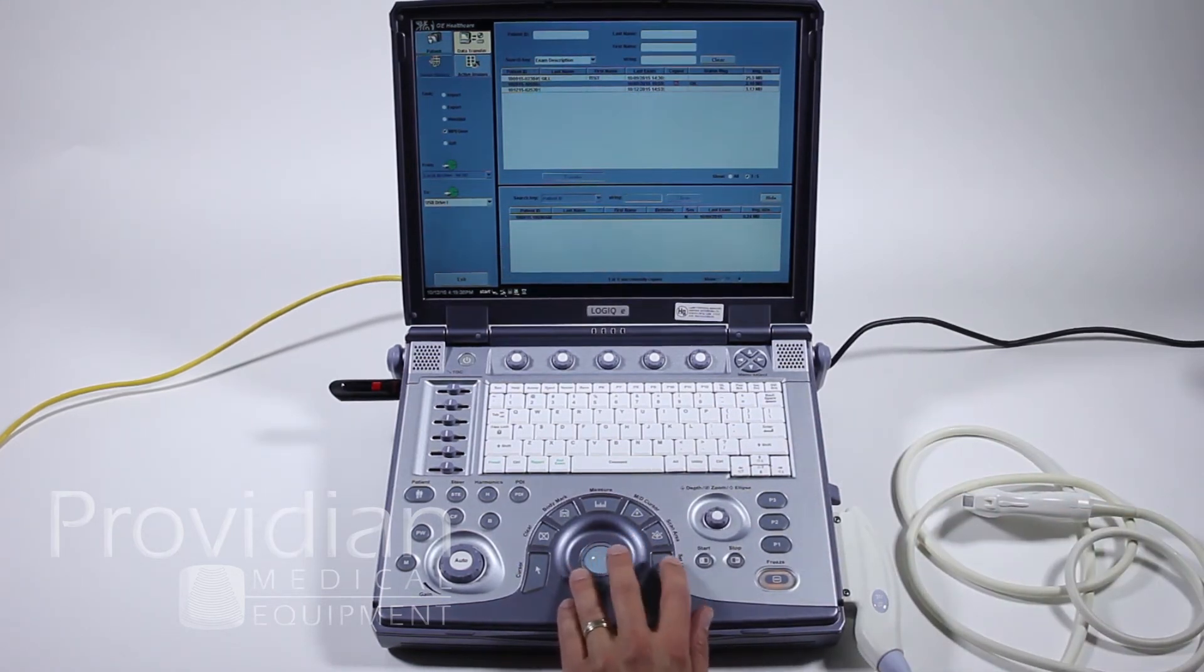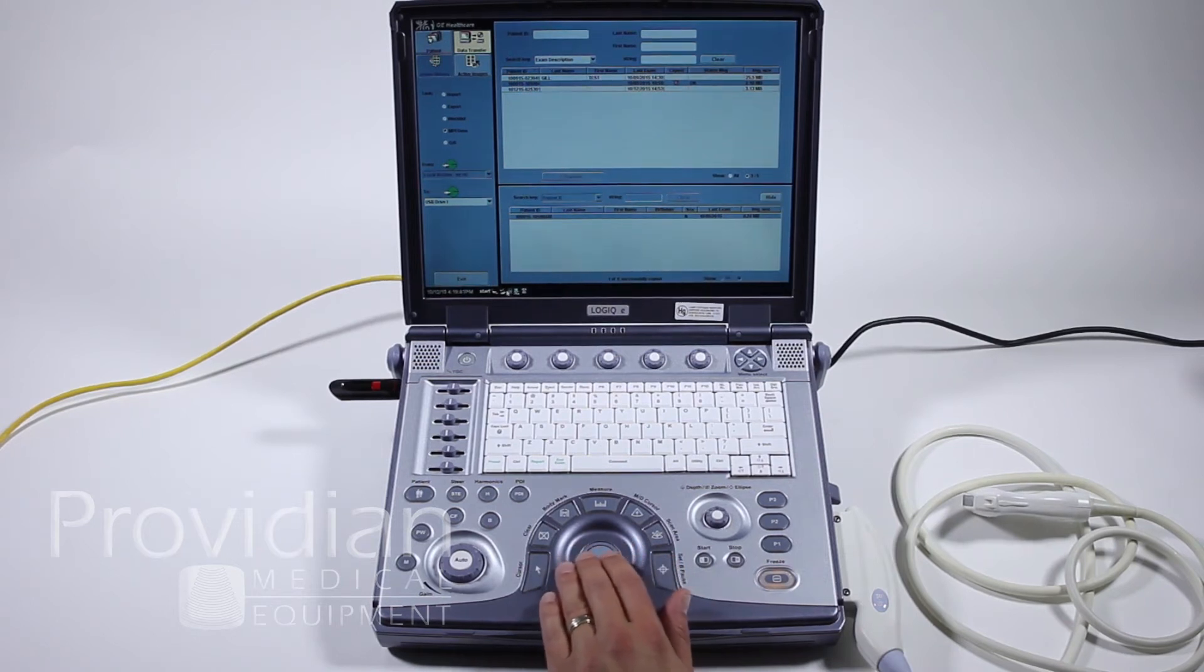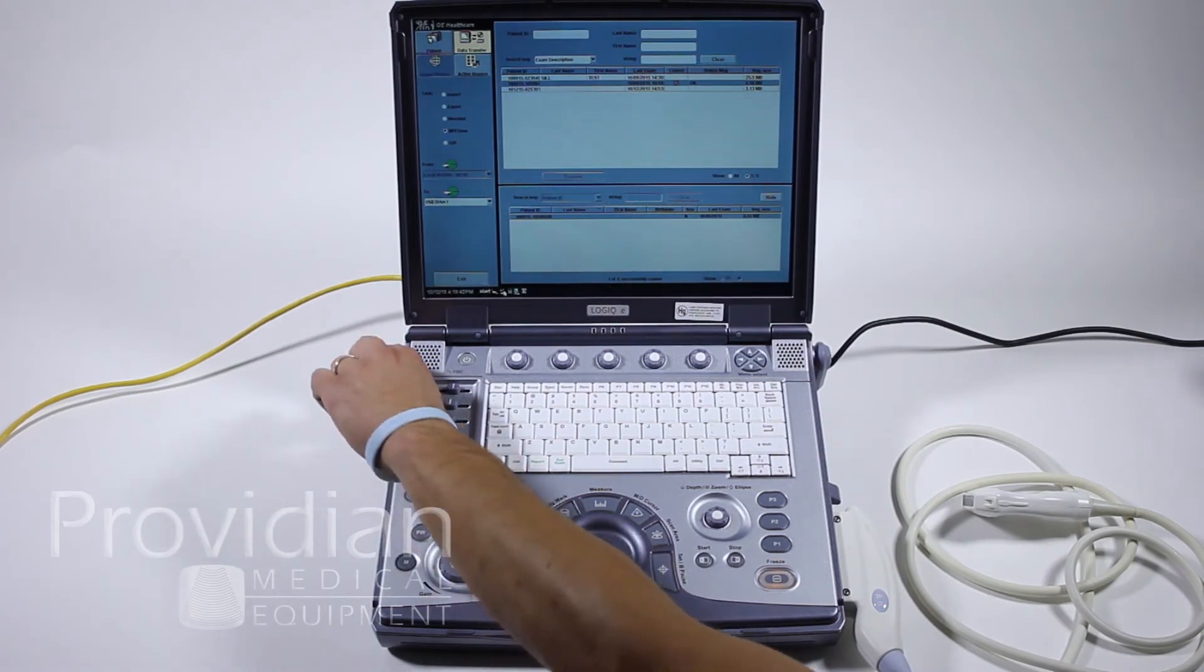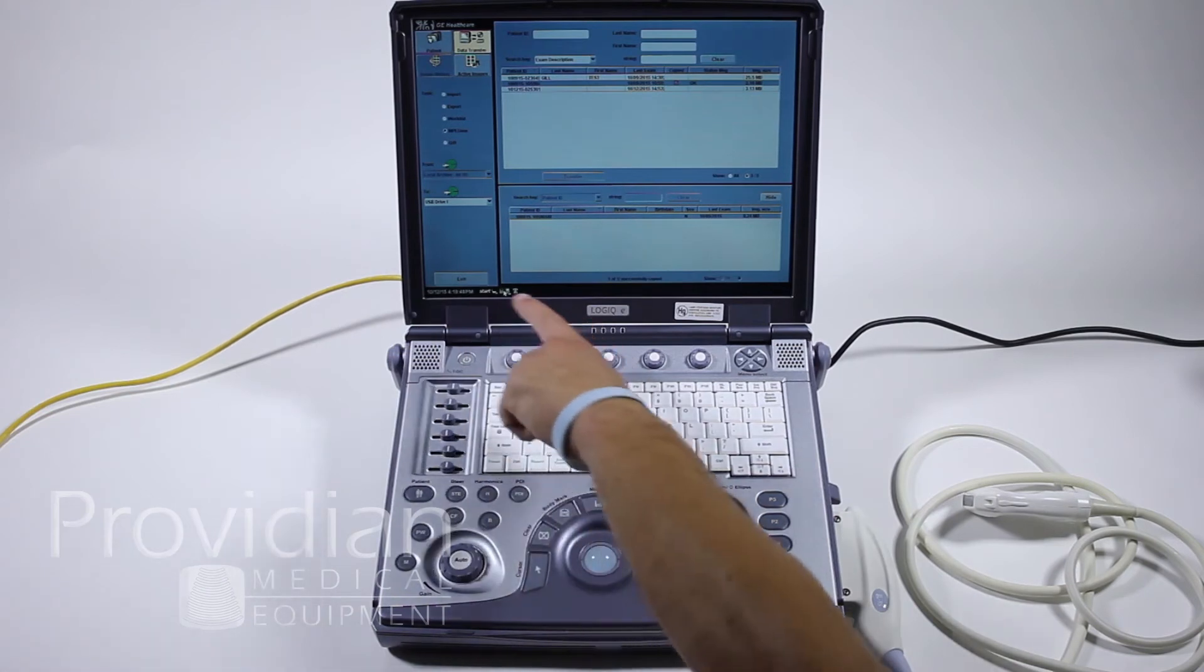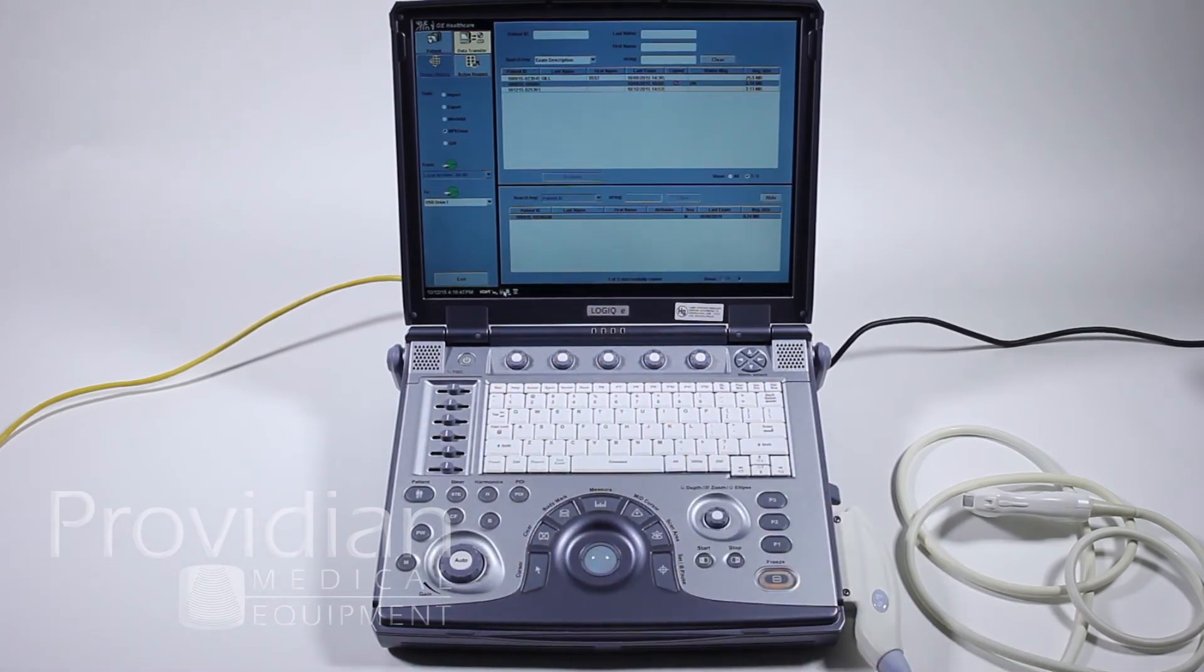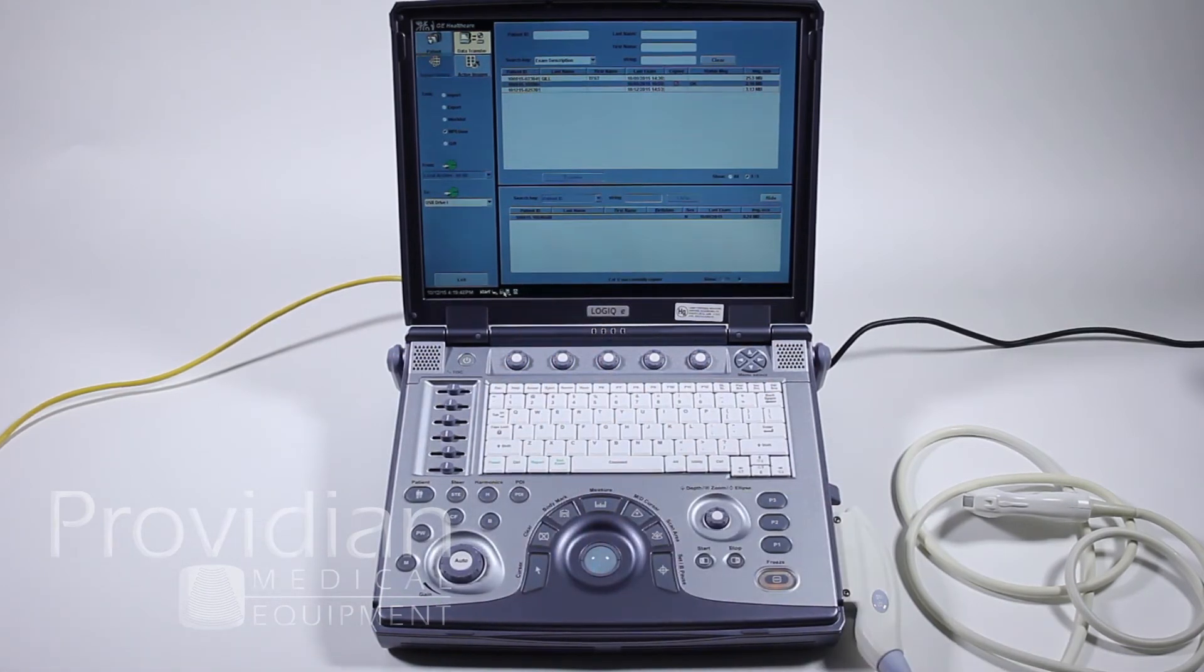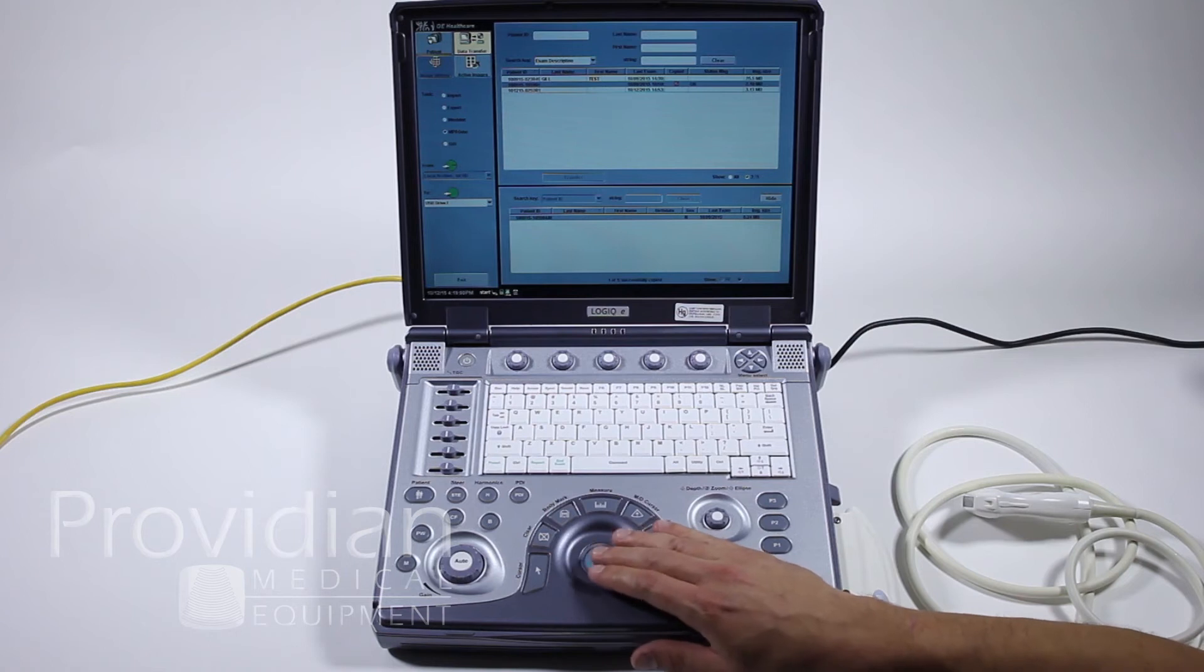Right here, it shows you that there's one connected. These are some icons showing you various things. I'm going to go ahead, take it out, and notice that the USB disappeared. Now I'll go ahead and exit from there.